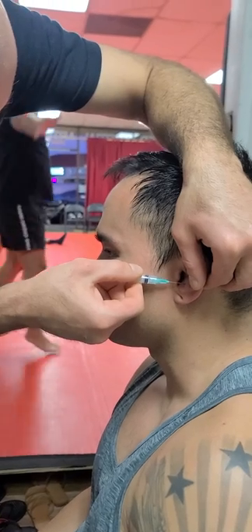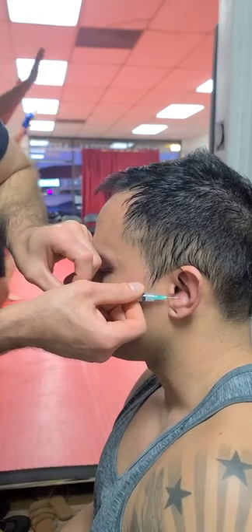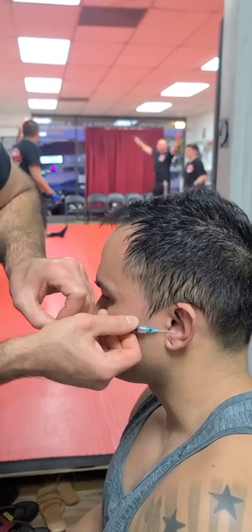And a little bit of pain — you felt it slide into the pocket. Now you just feel nothing. You're going to feel a little pinch once this blood starts to come out. There it is — you'll feel the pinch now because there's a needle in there and all the goo is out.